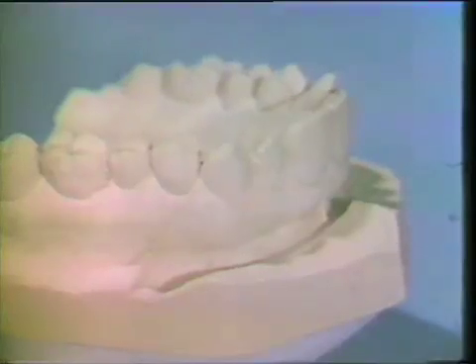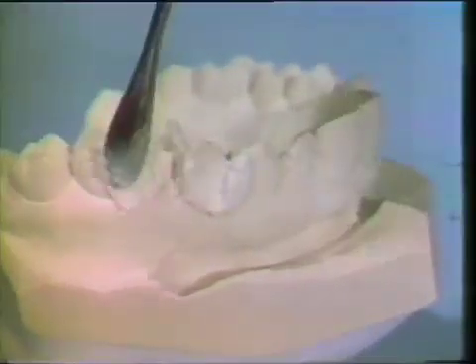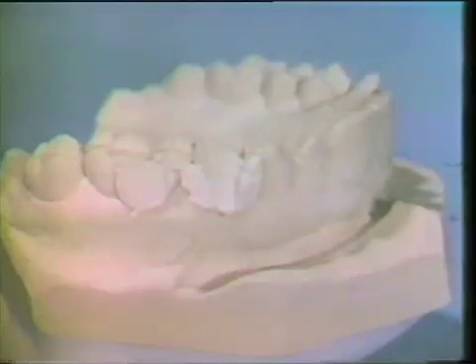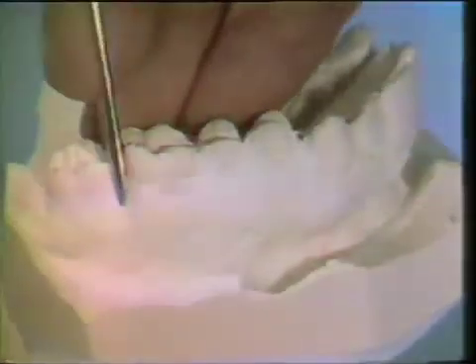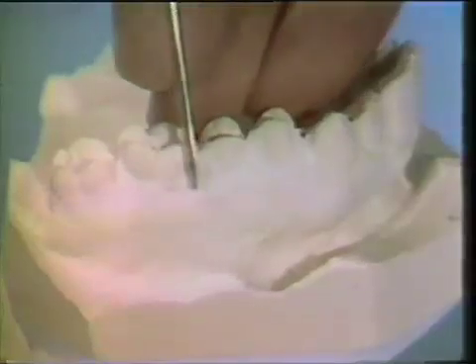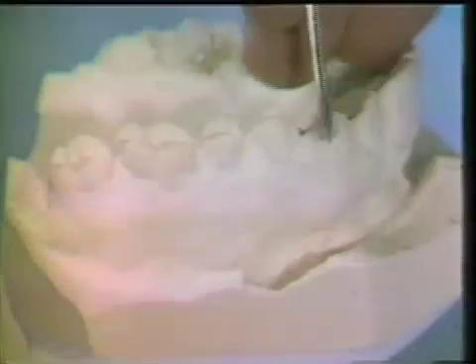Fabrication begins with the elimination of undercuts. Those undercuts related to the contour of the teeth are blocked out. The casts have been soaked in water. A soft mix of impression plaster is placed into the tooth undercuts. A wax spatula is used to remove excess plaster. Ultimately, all tooth undercuts, buccally and palatally, are blocked out.